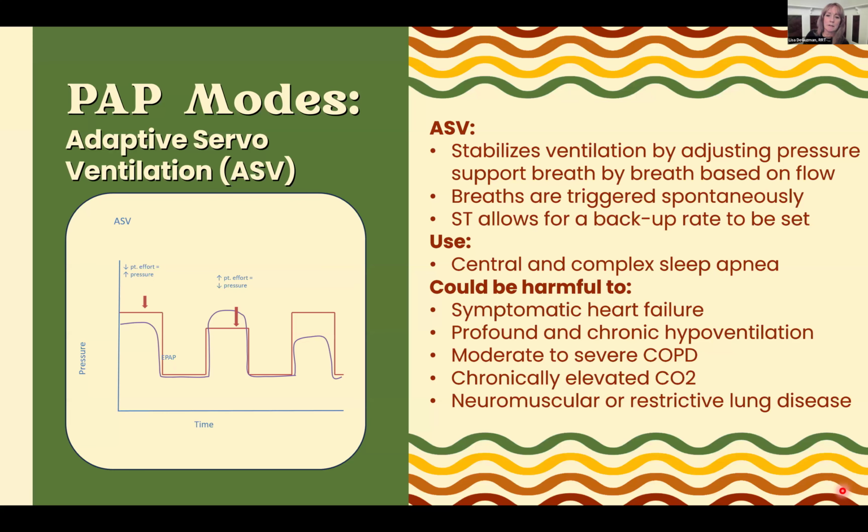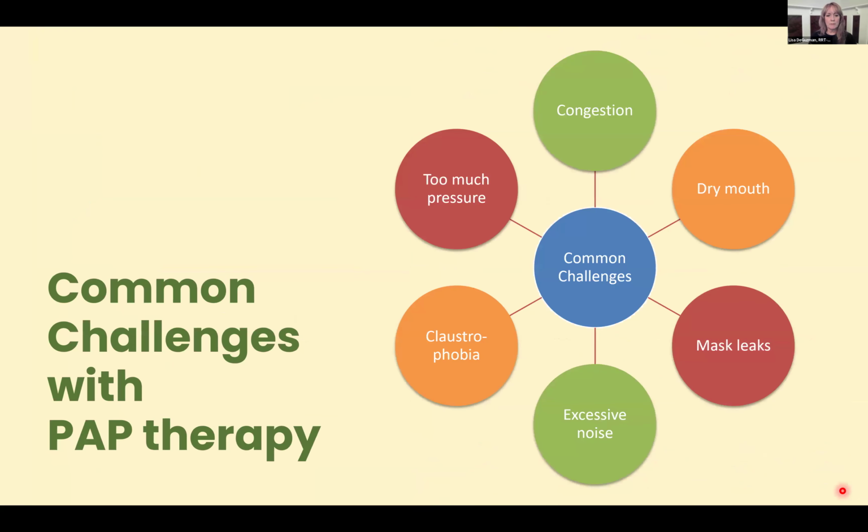And we're going to talk about that in a little bit. I thought I had the volume slide here. So with our neuromuscular patients, and I went through the list, obesity hypoventilation syndrome, restrictive lung disease, chronic respiratory failure, these are patients that we often go to volume ventilation for in our lab, AVAPs, IVAPs. And we'll talk about that a little more. Challenges.